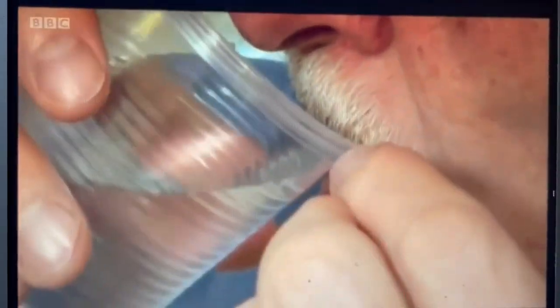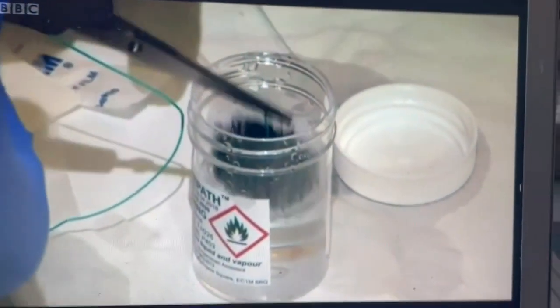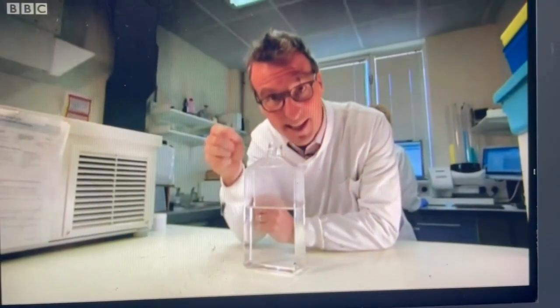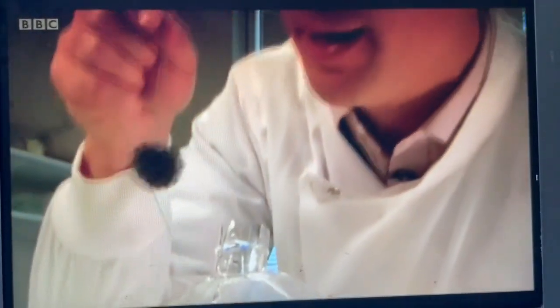It's the simple, cheap Cambridge invention designed to spot the early signs of cancer, called the cytosponge. I filmed this demo of how it works last year. You've basically got a sponge inside a capsule, and that is fed into the patient's stomach. Over the course of about 5 minutes, this happens. Once the capsule dissolves, you can pull the sponge back out up the patient's food pipe, where it gathers around 1 million cells you can then test for signs of cancer.